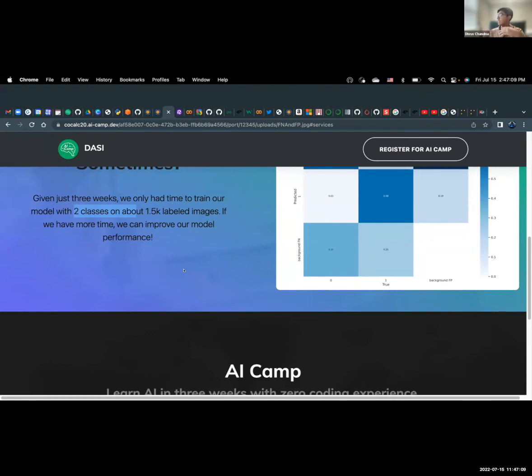So when you actually test it, that loss starts to go back up. So we were worried about finding the perfect number of epochs so that there would be no overfitting and the least amount of loss. What we did was run it 150 epochs just to see the graph and where the error is the least, so we could accurately know where to stop training this model.